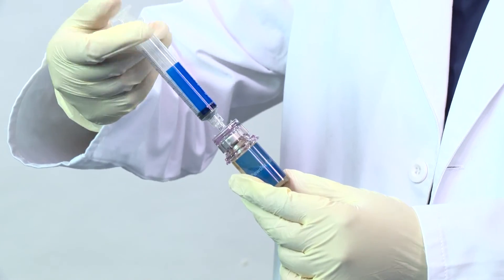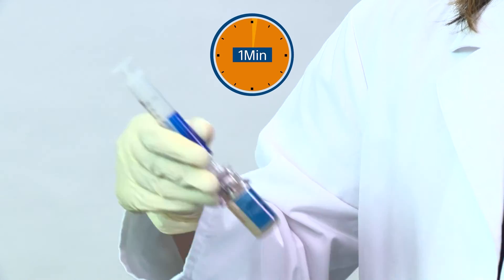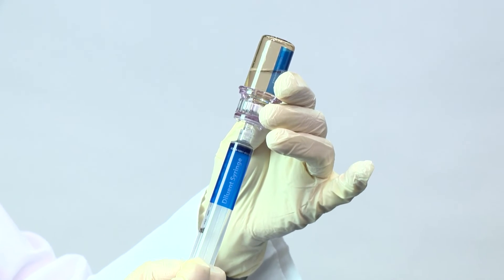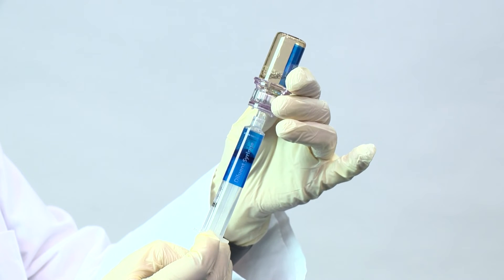Shake the vial syringe assembly until the powder is completely dissolved and set aside for approximately one minute. The solution may appear to be milky with bubbles. Invert the vial syringe assembly and draw 5 mL of precursor back into the syringe.